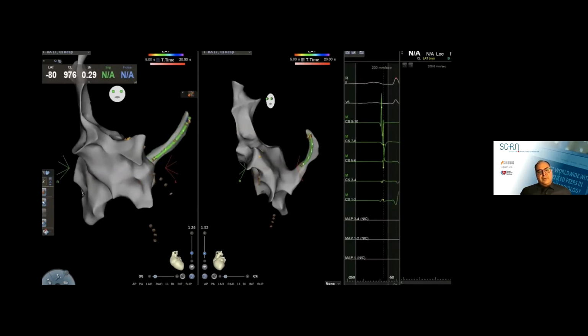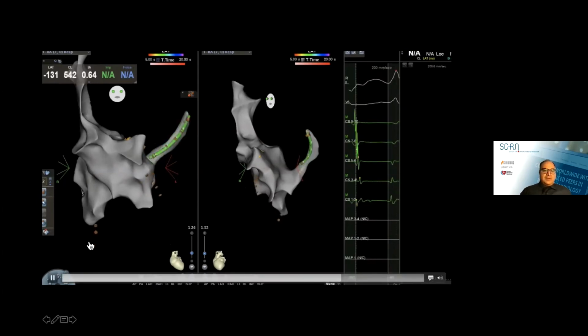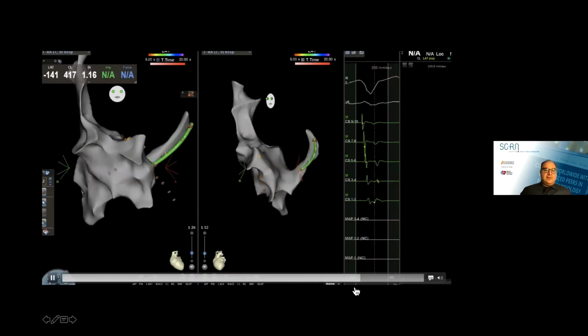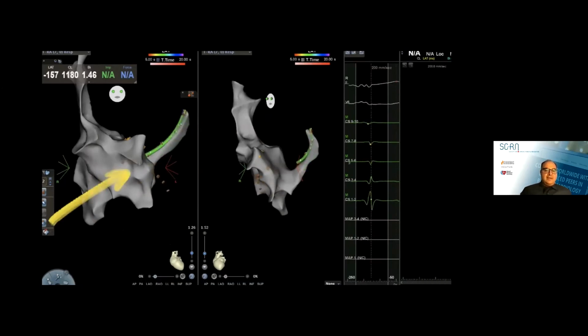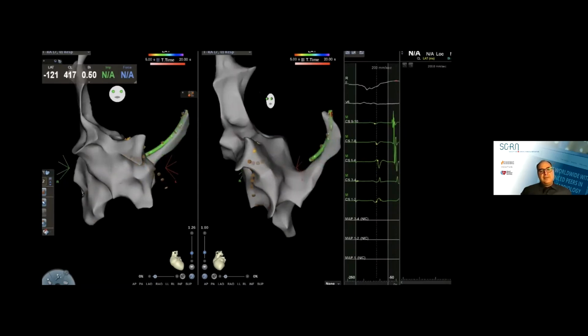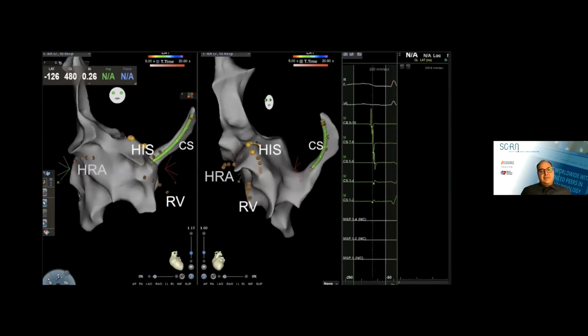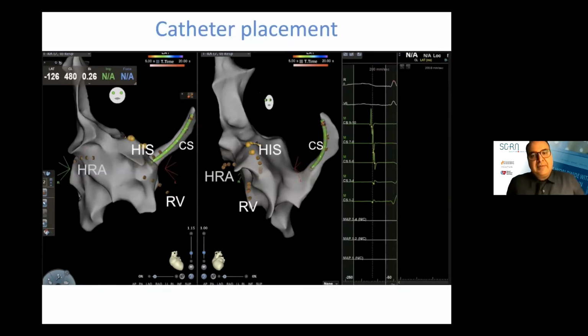The next catheter going up. And as you can see, they move this kind of funny way because they're impedance-based, really. These are not navigation-based. But when it gets to the atrium, you see atrial signal, as you can see here. This one is going to be placed over the His. And it's very easy to put it over the His because we already marked the His. So all you have to do is rotate it clockwise and counterclockwise till the catheter sits on the His. And the last one is a right atrial, so we'll put it somewhere lateral, high right atrium. So when everything is said and done, you have 4 catheters placed, and you have RAO and LAOs as if you're looking at the fluoroscopy. So that's how HRA, RV, CS, and His catheter.